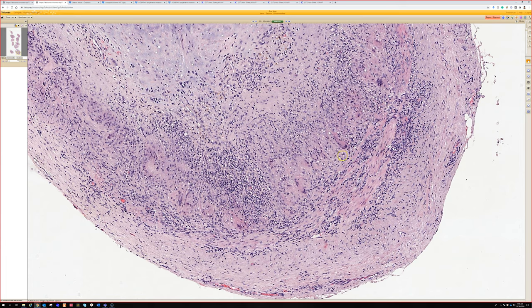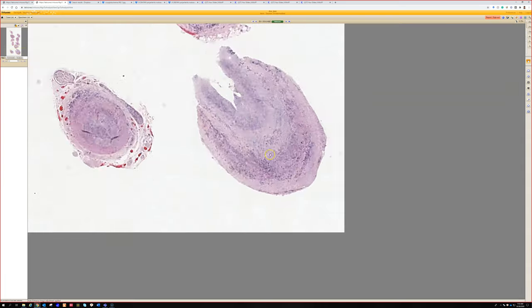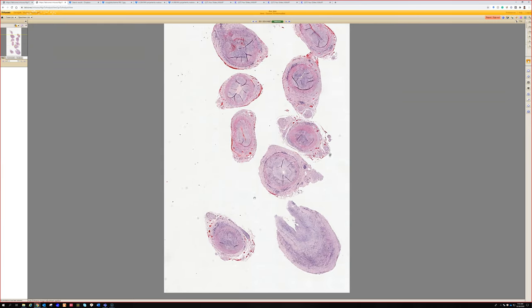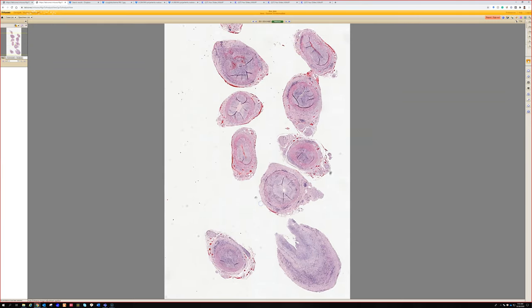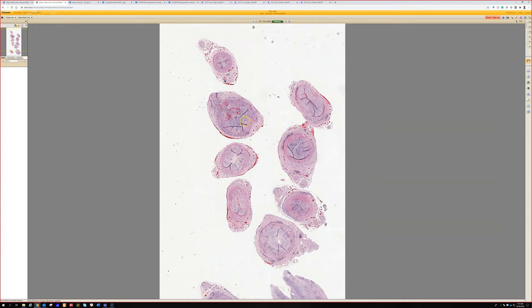This is a florid, nice, probably untreated example of giant cell arteritis of the temporal artery. It's got to be a muscular artery that they're biopsying. They give us a length of temporal artery, we cut it up in the lab into small pieces, and it gets embedded very carefully by a skilled histotech to make sure they all stand up right — sometimes using agar to get them stabilized.